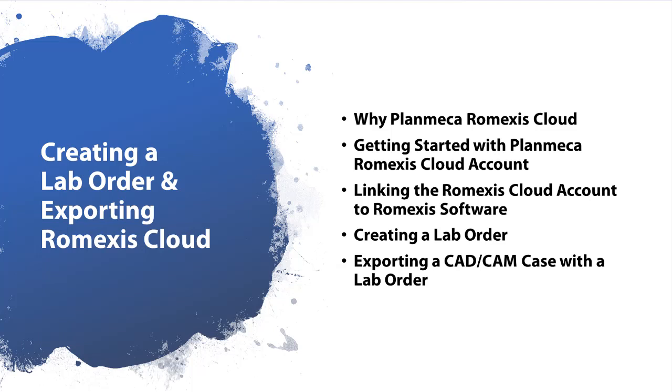This video will not only talk about creating a lab order and exporting the case using Romexis Cloud, but we will discuss why we're going to use Planmeca's Romexis Cloud account. We'll show you how to get started with Planmeca's Romexis Cloud account. I will show you linking the Romexis Cloud account to the Romexis software. We'll show you how to create that lab order, and I will show you how to export a CAD-CAM case with the lab order.